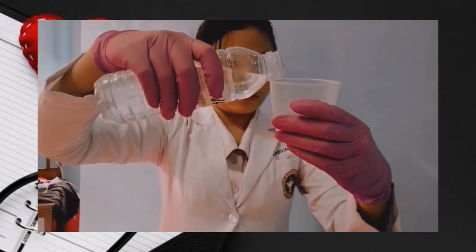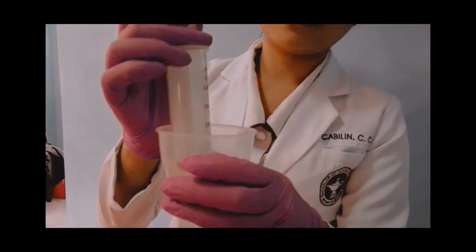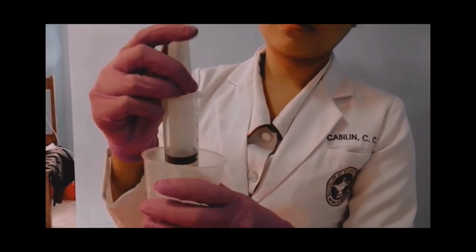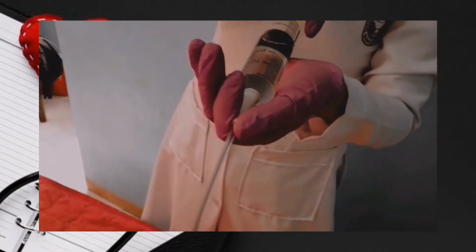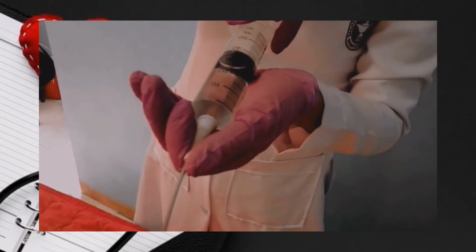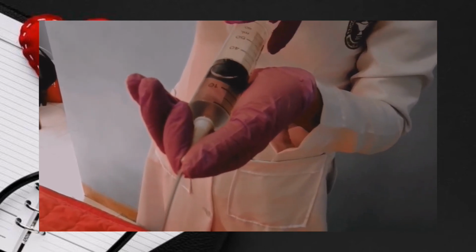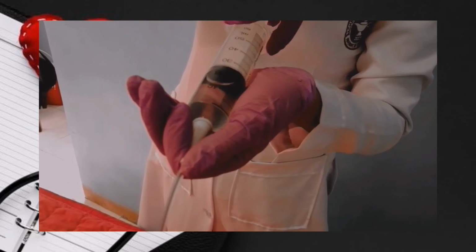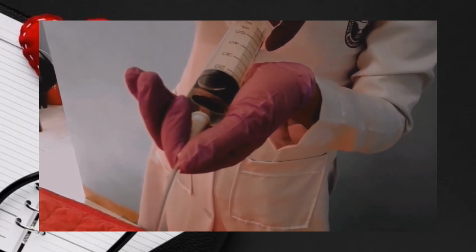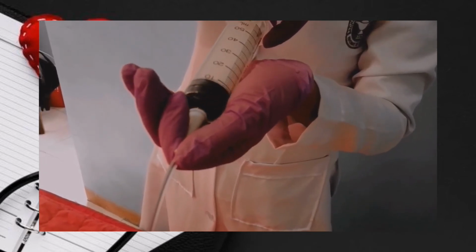The next procedure is to pour warm water into a cup. Draw up 50 ml of warm water into the syringe. The next procedure is to gently irrigate the tube with the water. If the patient coughs or appears to be choking, do not administer feeding and notify the physician. Flush the nasogastric tube with 50 ml of water every 8 hours to prevent clogging. This is to maintain patency of tube.